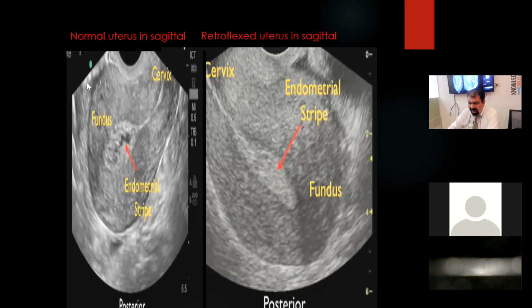Now here I have the bladder, which will be on this side. First of all, make a habit of making the patient wait for at least 5 minutes. What we are doing is asking the patient to empty the bladder and straightaway lie on the bed. No, wrong, because I want some bladder for orientation purposes. If the patient waits for a couple of minutes, meanwhile you can scan the next patient. So the patient will have a minimal, small bladder, for orientation purposes.